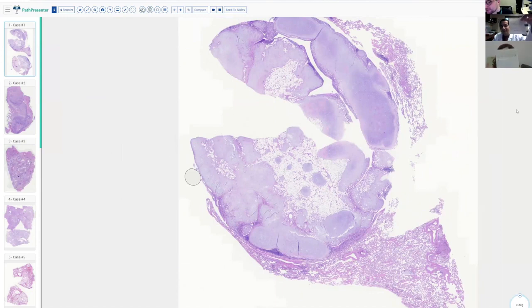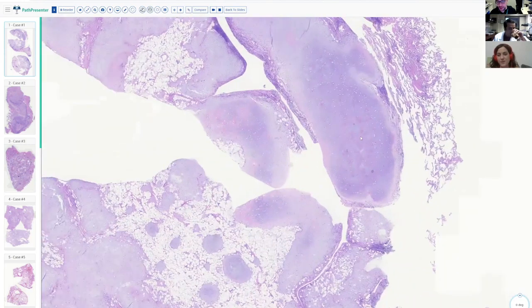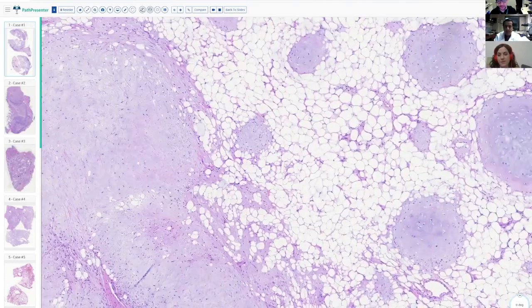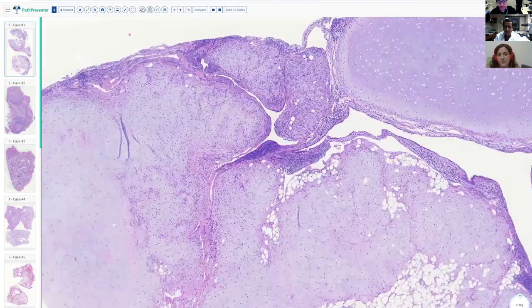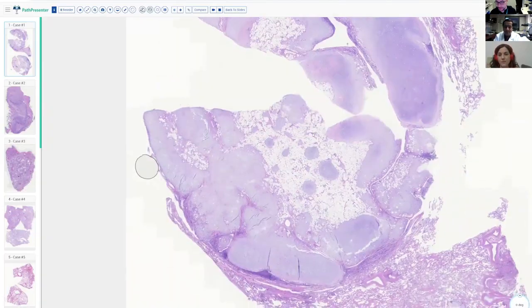So we have hamartoma and hamartoma. Perfect, great. That's exactly what this is. I think this is a classic spotter that can commonly occur in practice or on exams. At low power we have this really nicely well-circumscribed lesion composed of a mixture of mature cartilage tissue, this other more loose chondromyxoid tissue, as well as mature adipose tissue. A key point is that you can also get entrapped bronchial epithelium, so don't be dissuaded by this and end up calling this malignant. This is an important diagnostic feature of these as well.